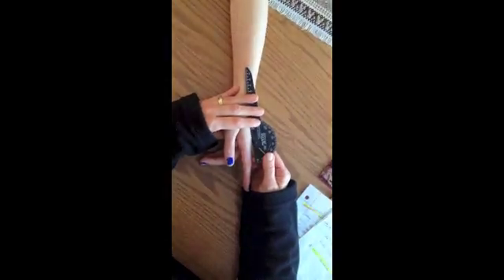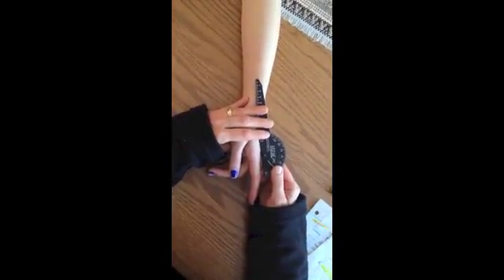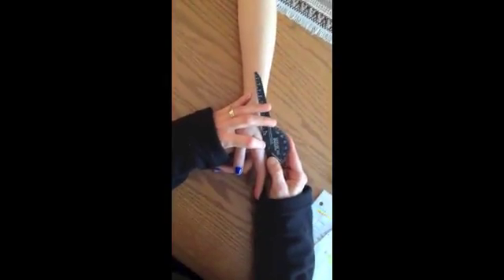We are assessing the active range of motion for the metacarpal phalange joint with a goniometer for extension. The axis will be at the metacarpal phalange joint — the knuckle, the MCP.